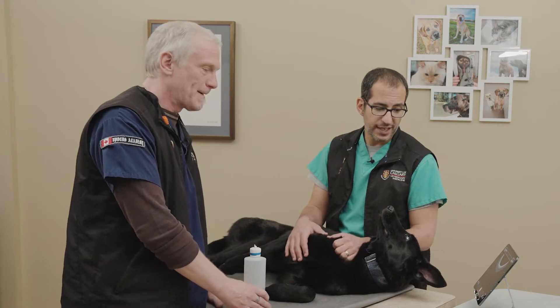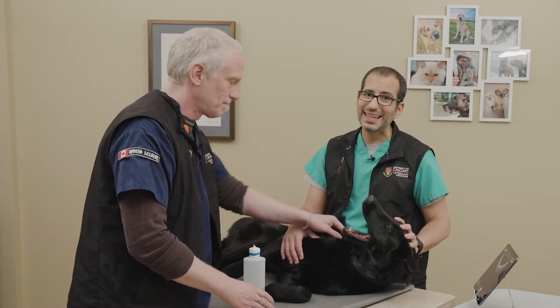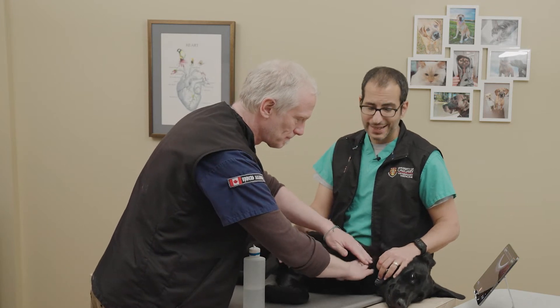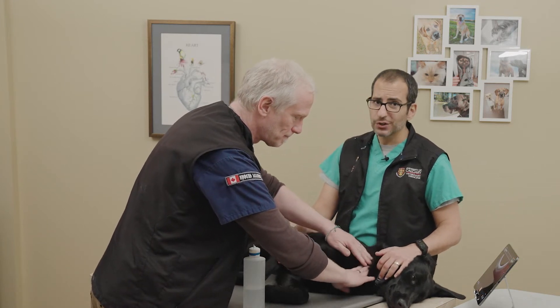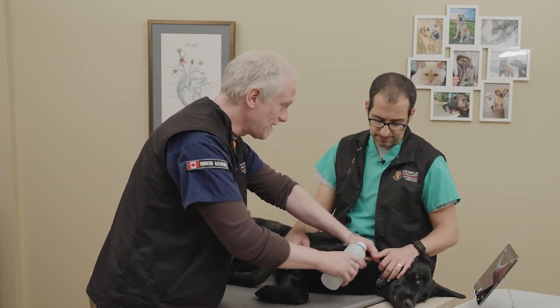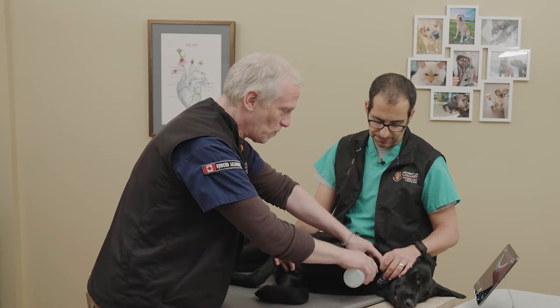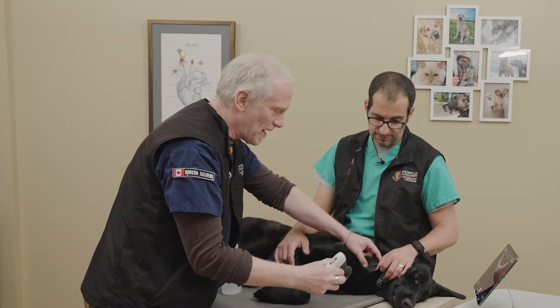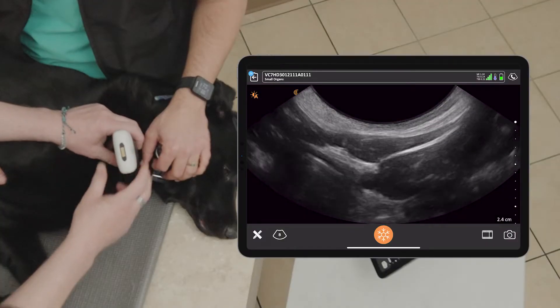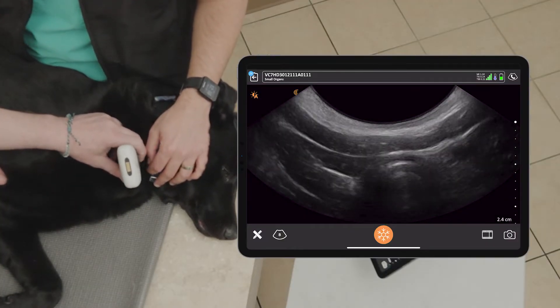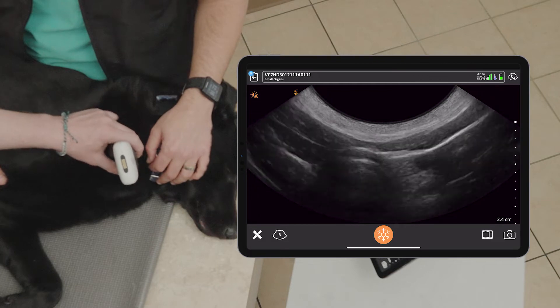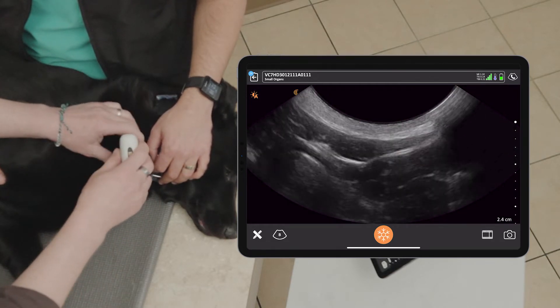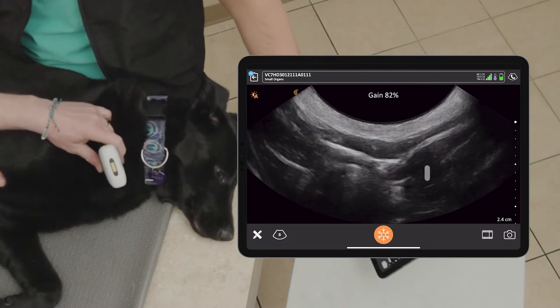That's really cool about these presets because it automatically will increase that frequency for you, which is what you need for superficial structures — that is pretty fantastique! So we'll put some alcohol on, part the fur. I like to do my vascular access in short axis; I tend to prefer the short axis over the long axis orientation when I'm doing vascular access. We'll come in at the jugular furrow, part the fur, and see if we can pick up the vessels.